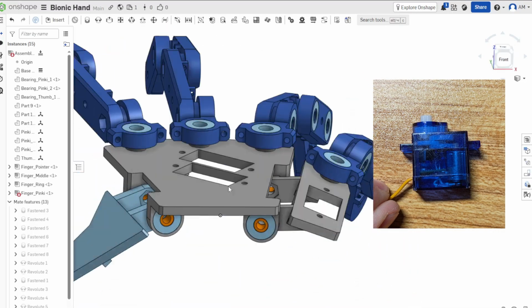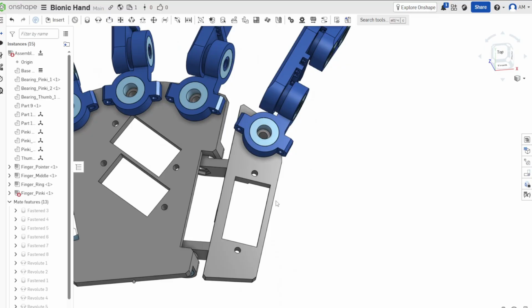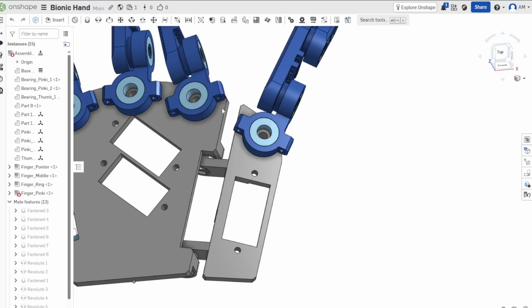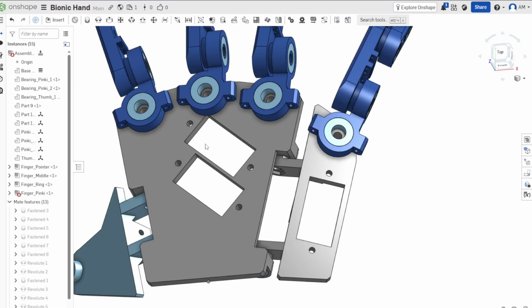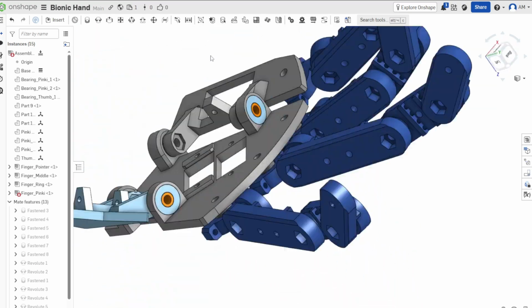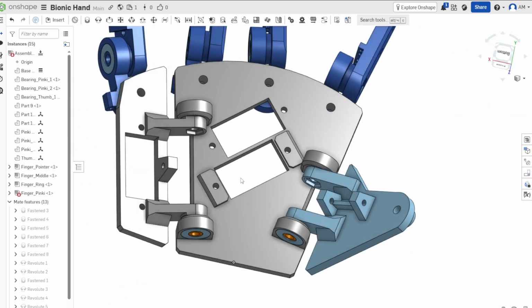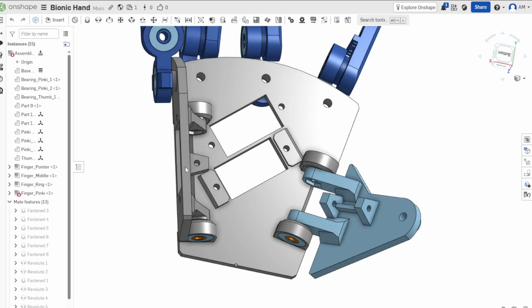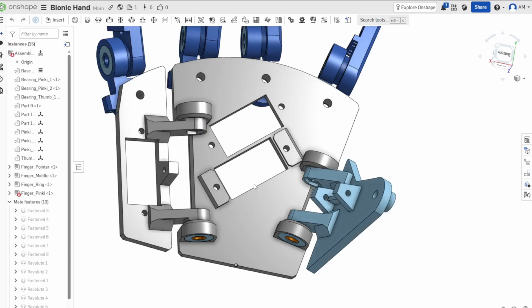And the way these will probably operate is that I'm going to need to rework it, but this servo right now probably will drive both of these fingers' rotation by pulling strings on it, and this top servo will probably drive these two, and this bottom servo, if we look underneath, it'll have a head that connects to this bit and that bit to cause the hand to basically fold in.